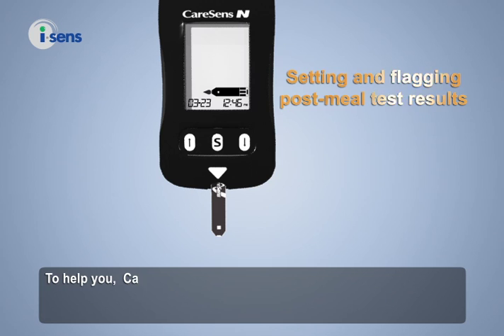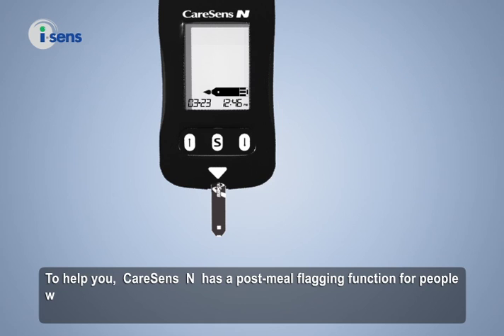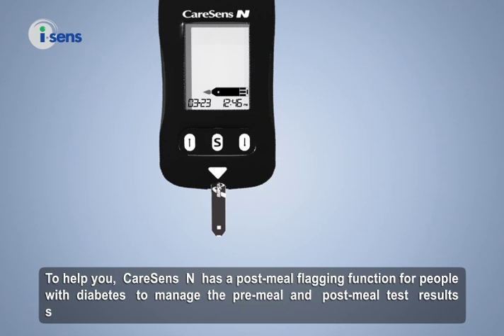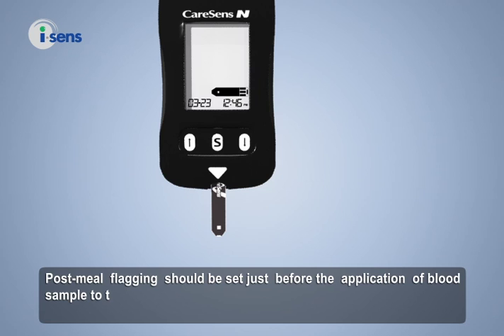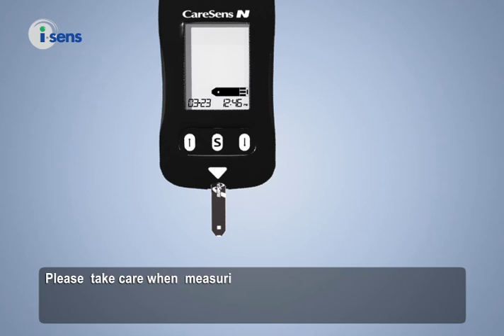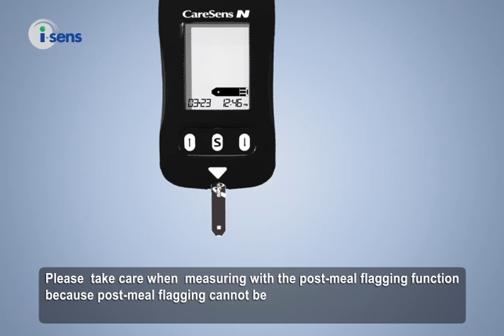CareSense N has a post-meal flagging function for people with diabetes to manage pre-meal and post-meal test results separately. Post-meal flagging should be set just before the application of the blood sample to the test strip. Please take care when measuring with the post-meal flagging function because post-meal flagging cannot be deleted.